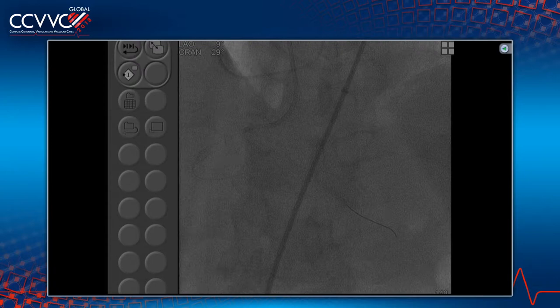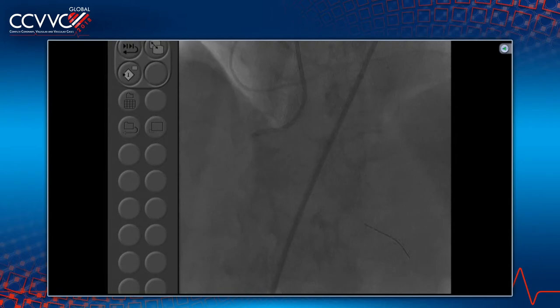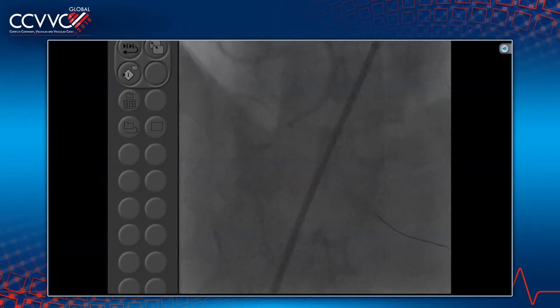That's a good point, and that could have been a good case. Particularly, the laser works very well when there is a focal area, not super long, that has the resistance, and you blow up that area essentially and go forward. It's a non-FDA approved use of the laser. Of course, it's laser plus contrast, where otherwise you avoid the contrast. Now you see here I'm having trouble, but that should be okay.